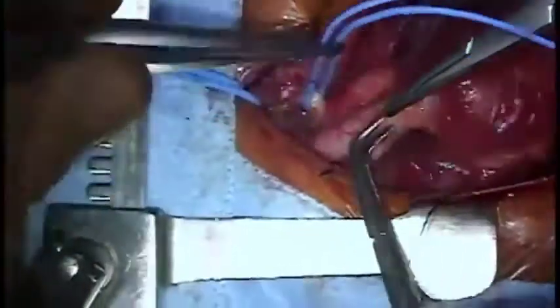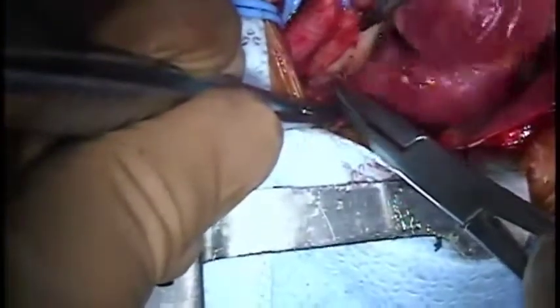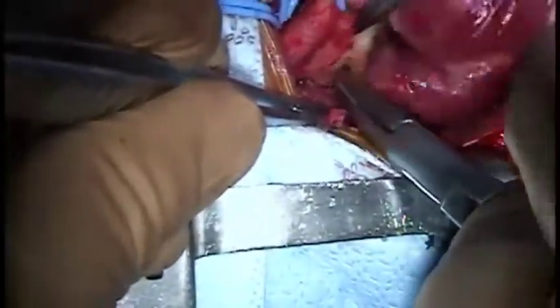The left ductus seen here is double looped, as it will need to be occluded as soon as cardiopulmonary bypass is initiated in order to control pulmonary blood flow. Here the much larger right-sided ductus is dissected free. This vessel gives rise to the descending aorta. The aortic isthmus joining the arch with the descending aorta and right-sided ductus is quite small but large enough to provide lower body flow during bypass.